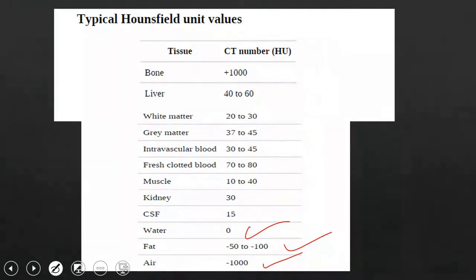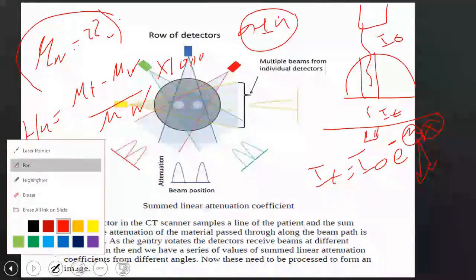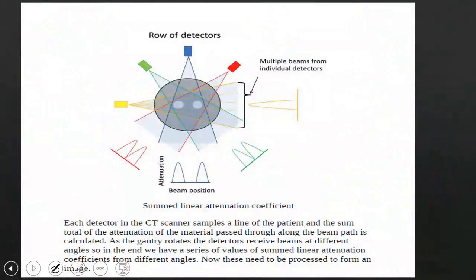This expresses the amount of attenuation that occurred. The attenuation is considered the significant factor in this whole story. It is the significant factor in all these values which express the CT number of the tissues present. So the point is, we will explain it in image reconstruction.